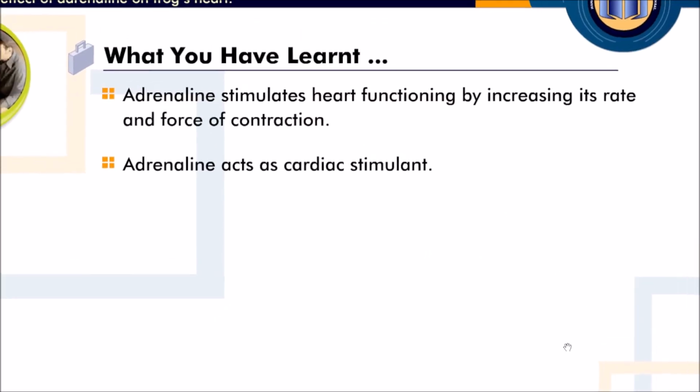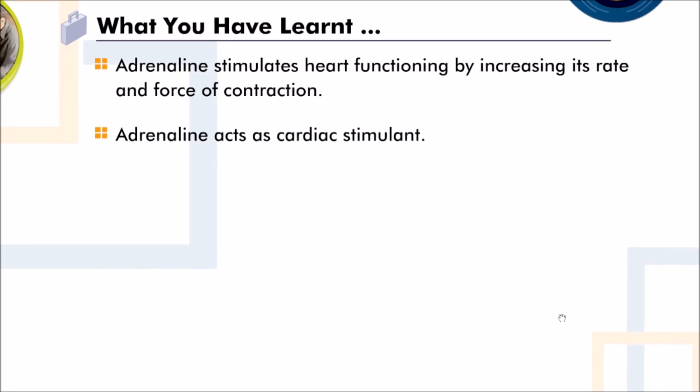You have learnt that adrenaline stimulates heart functioning by increasing its rate and force of contraction. Adrenaline acts as cardiac stimulant.